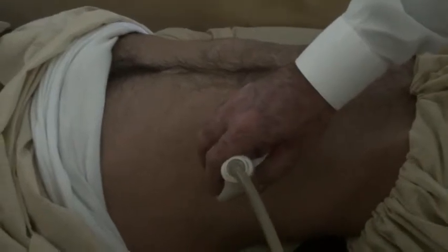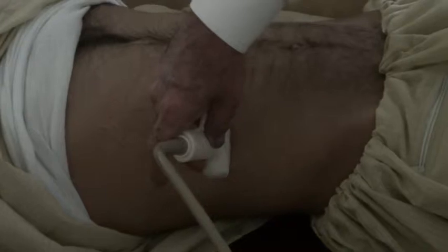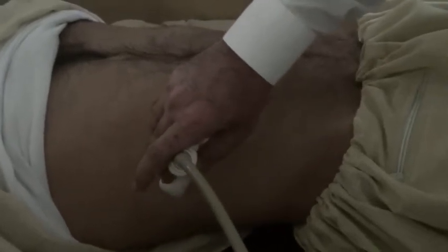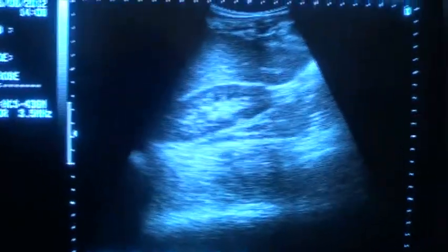I get the kidney in total in longitudinal section, and from here, where I get the total kidney in longitudinal section, I will give a 90-degree probe turn, and I will get the transverse section of the kidney, and then I will move the probe cephalad and then caudally to see if there is any pathology I am missing. So now let's see from the same location what I have showed you.